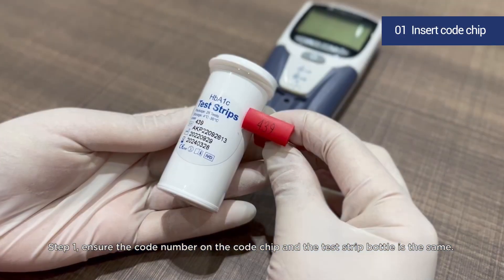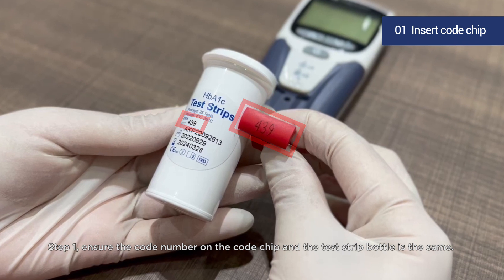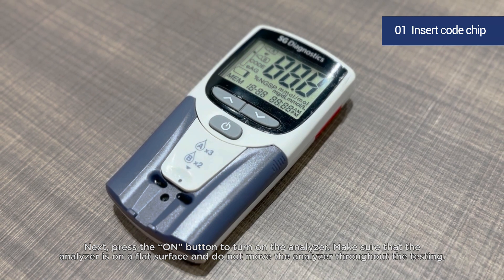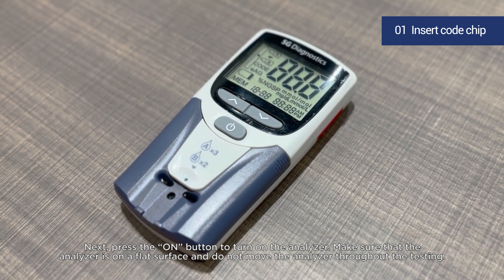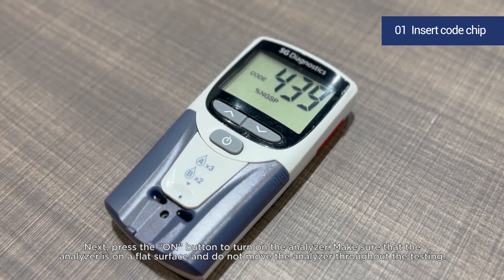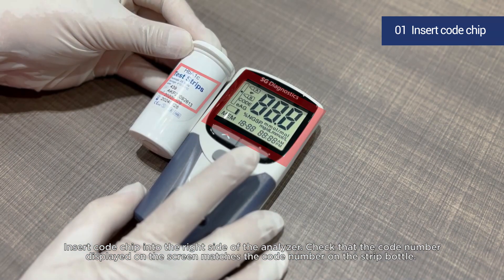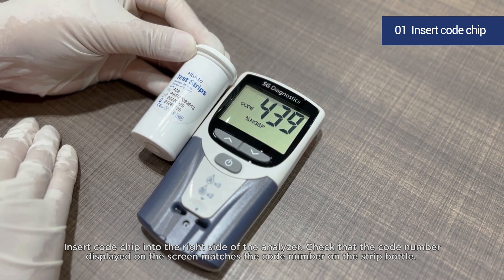Step 1: Ensure the code number on the code chip and the test strip bottle is the same. Press the ON button to turn on the analyzer. Make sure that the analyzer is on a flat surface and do not move the analyzer throughout the testing. Insert the code chip into the right side of the analyzer. Check that the code number displayed on the screen matches the code number on the strip bottle.